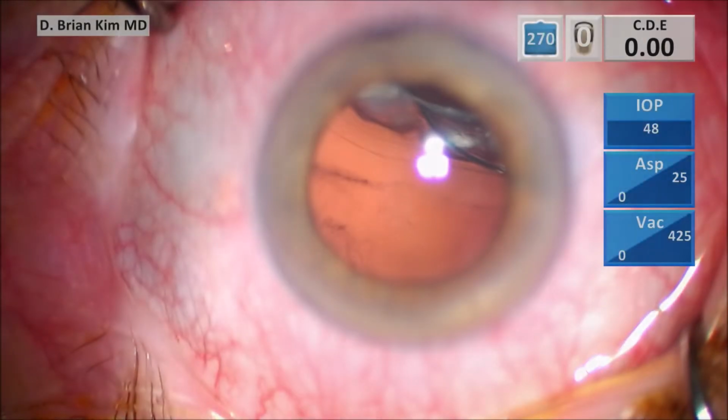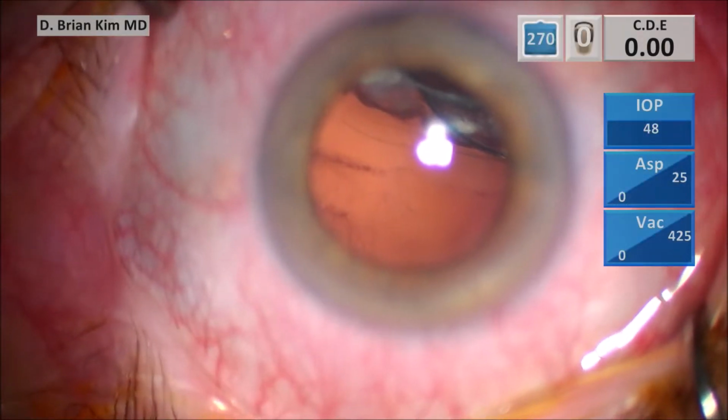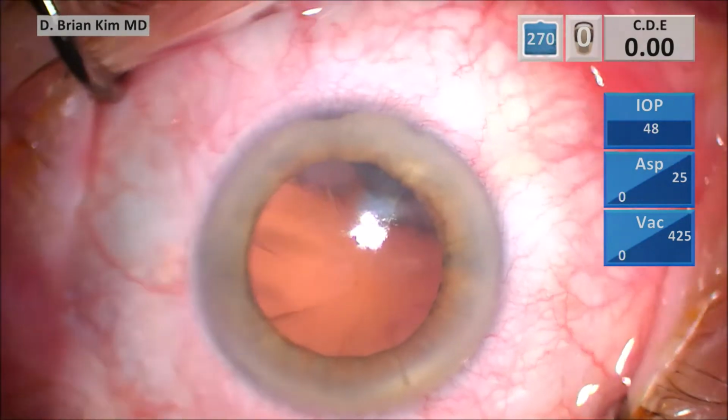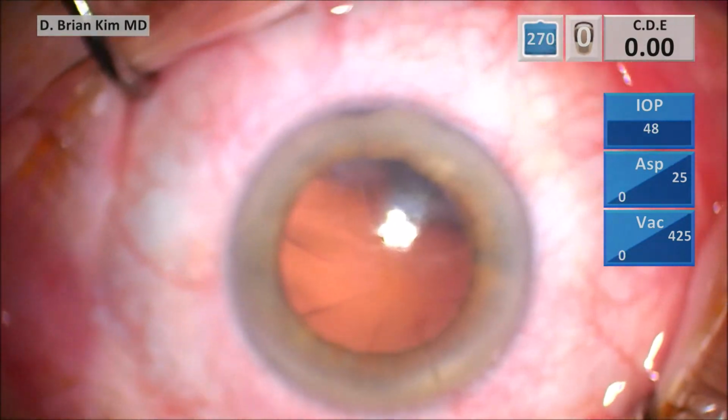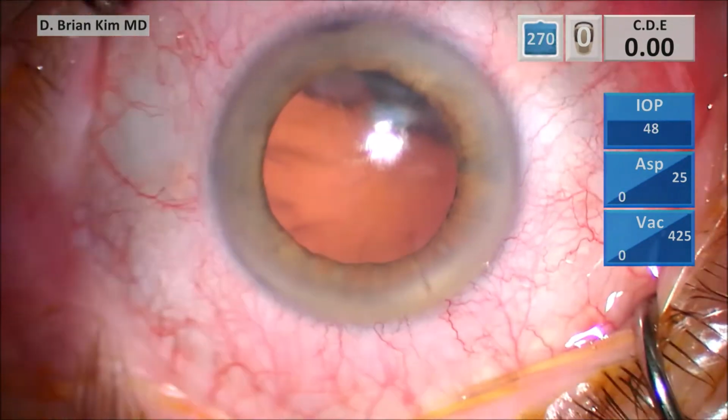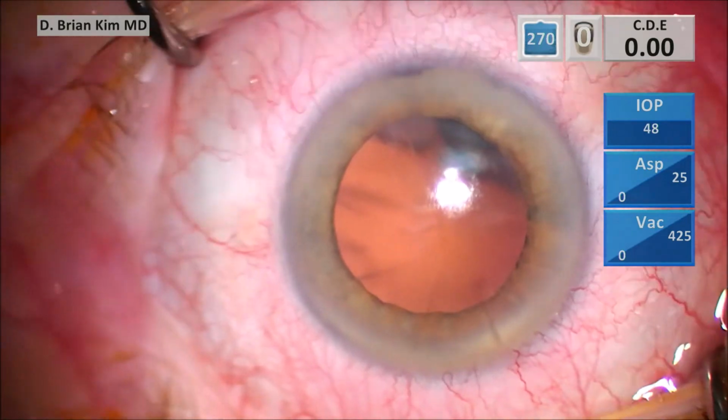This looks like a three-piece lens. And you can see this patient's moving their eye. You can see the RK scar. So this patient's had RK, high myope, and she's also had a previous vitrectomy. So that complicates things as well. Previous vitrectomy, and obviously then there's going to be less vitreous support, and that's why this lens is falling back. And so it's very important when the patient's sitting upright and you see it sitting that far back, it also means that when the patient lies down, it's probably not going to be easy to access.